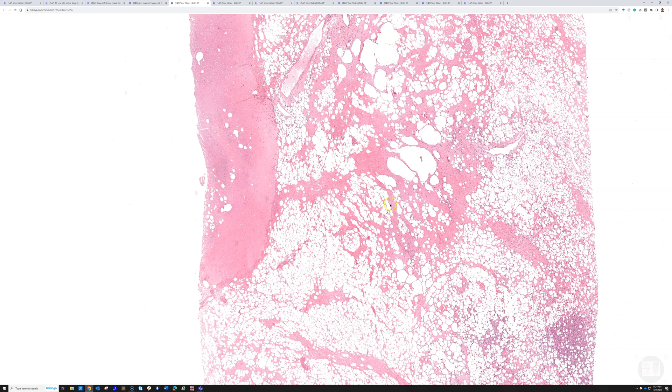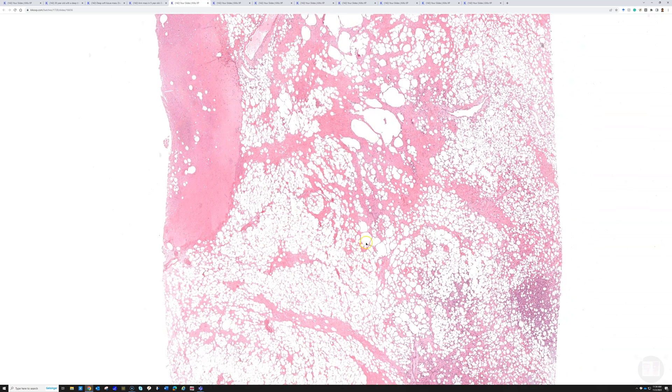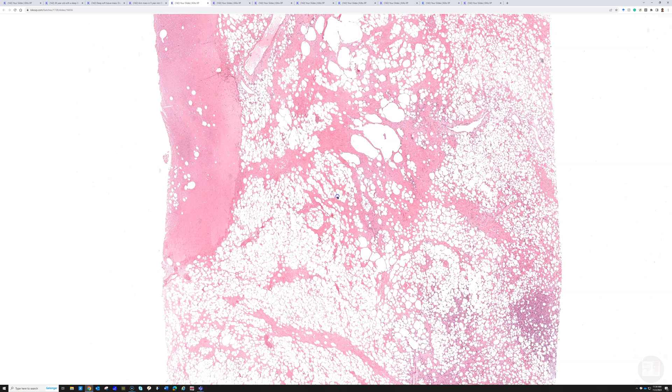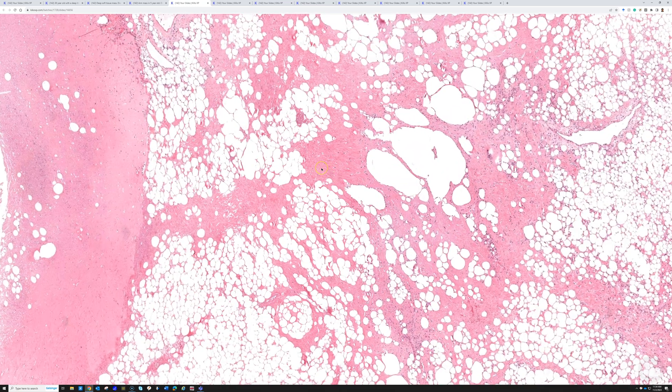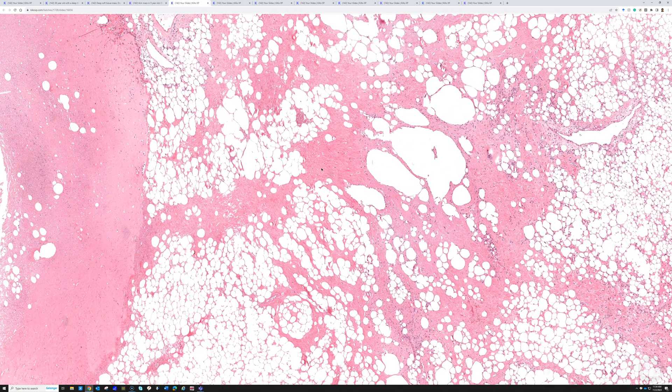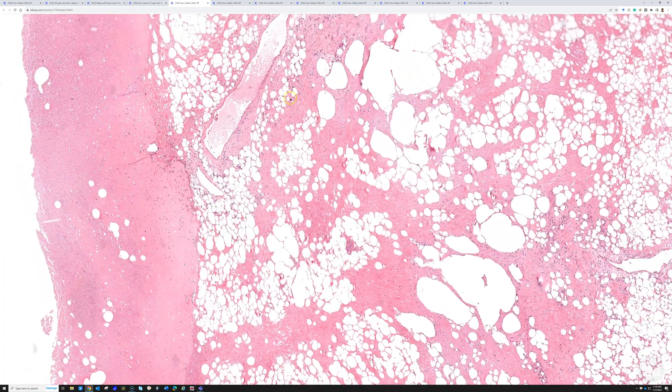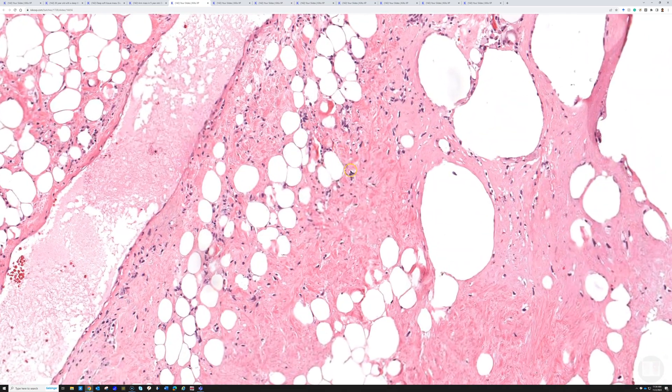The three things I look for in well-differentiated liposarcoma are: mature fat, usually with variable size adipocytes - large, medium, and small - fibrous bands in between with dense hyalinized sclerotic collagen, and scattered hyperchromatic atypical cells.